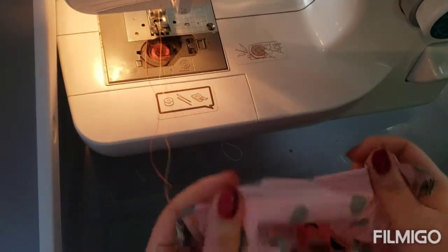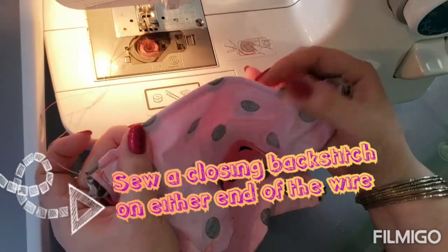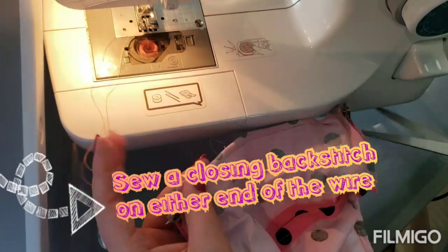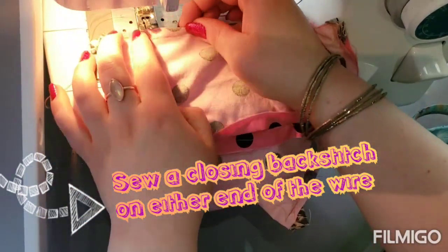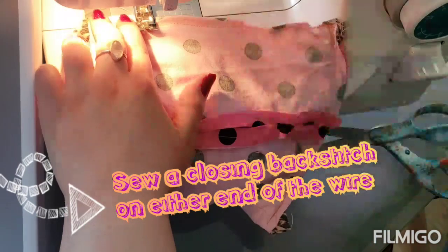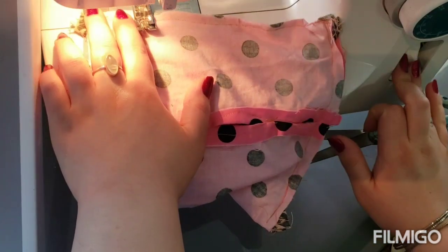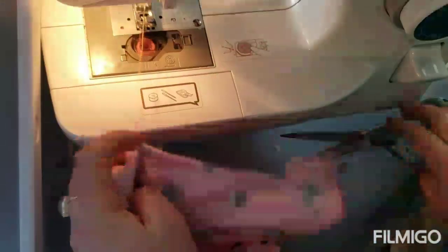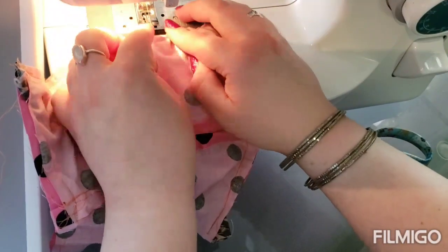Now find the two ends of the wire and sew a little stitch right there so that they don't wiggle. Do that for both wire ends.